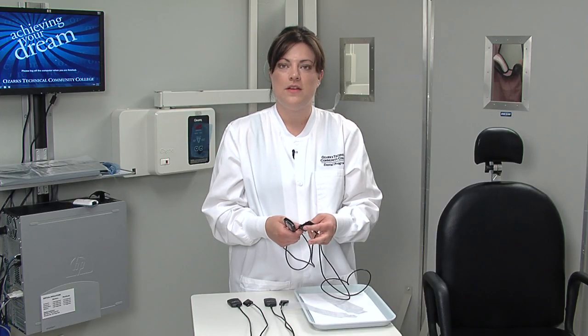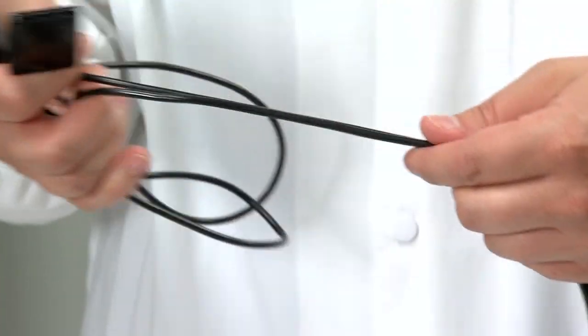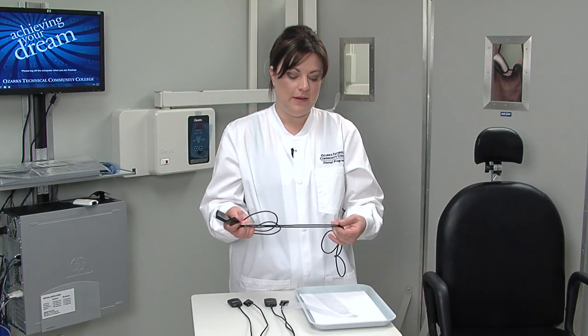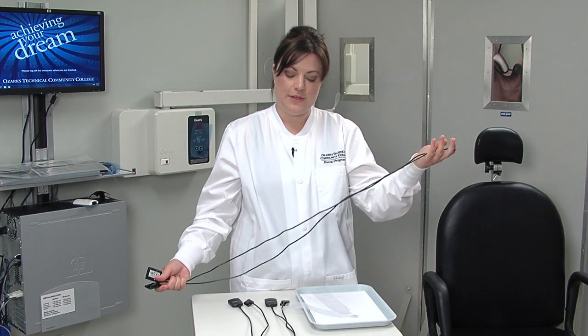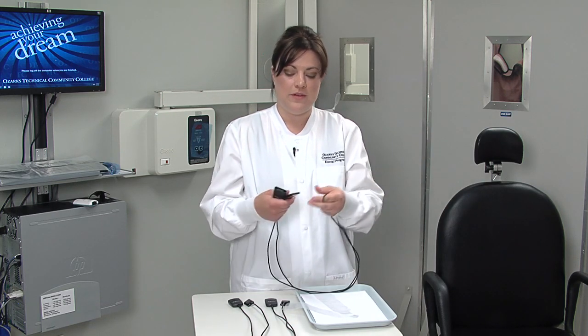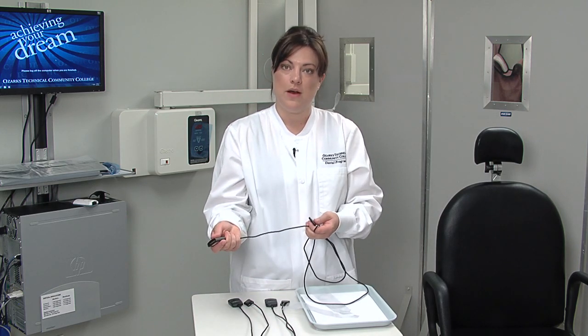When using the digital sensor for full mouth radiographs, one thing you have to be mindful of is not to excessively bend the cable. So every attempt should be made to keep it as straight as possible. When it's stored, it should be hung up like so, and the cord should be stored in a straight manner. And then when you're using it on the patient, obviously it's going to drape as straight as possible.